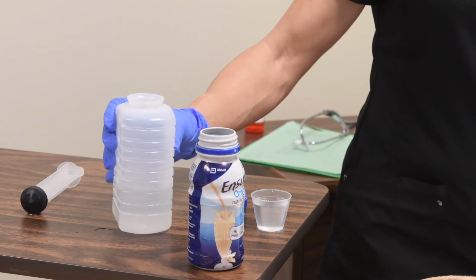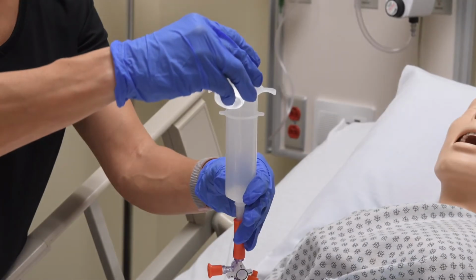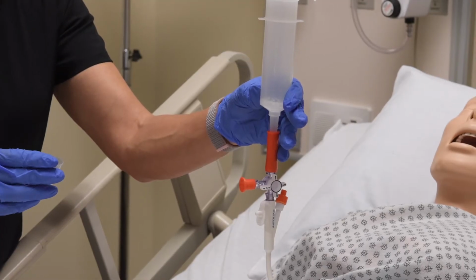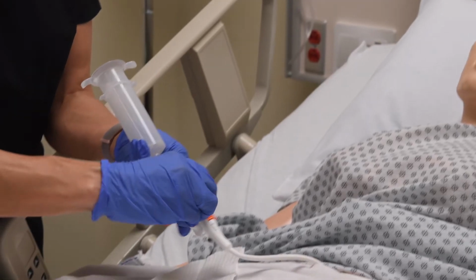Once I'm done with that, then I'm going to administer 30 mLs of water. Feel okay? Now I'm going to turn this off.